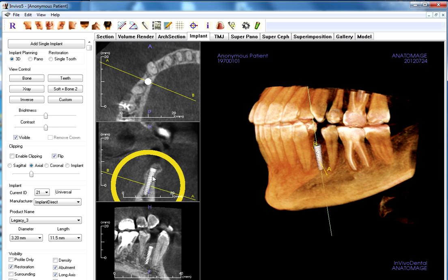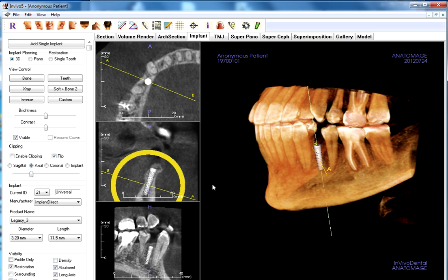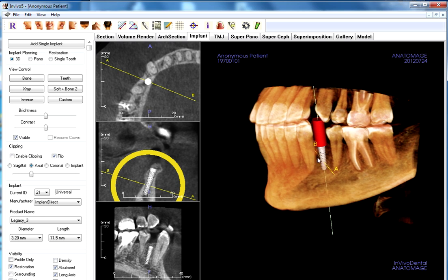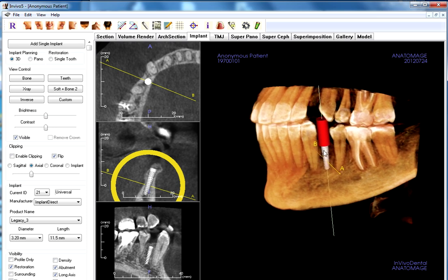You can tell it's kind of a tight fit. Let me nudge it a little bit more lingual. Not looking too bad. I want to toggle on the trajectory — it's a red cylinder that gives me an idea of where this implant is placed as far as an orientation to the other teeth. Toggle that back off.